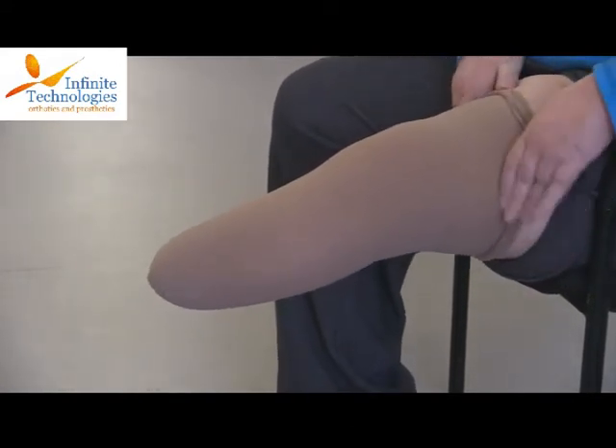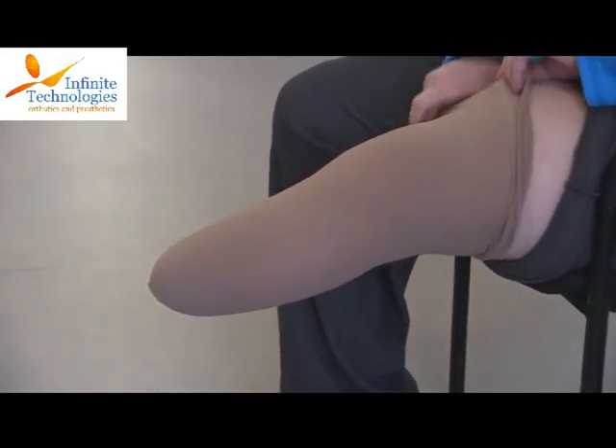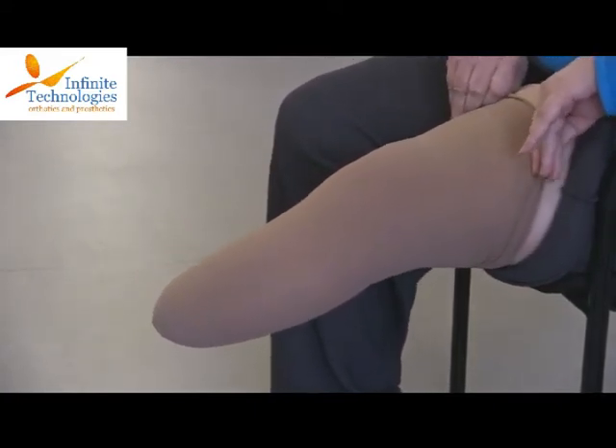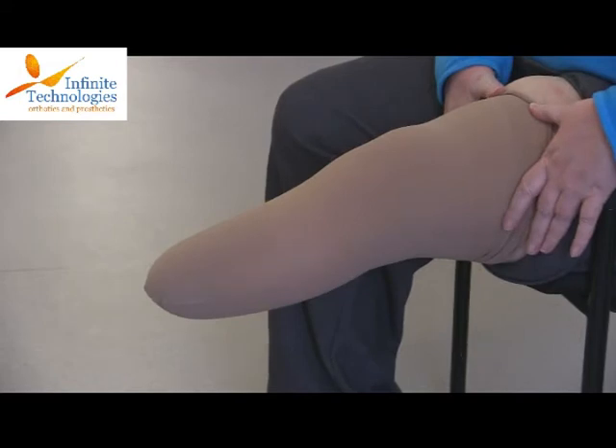It is important to pull the shrinker above the knee so that it does not bunch behind her knee, which can lead to pain and discomfort. Make sure there are no wrinkles in the shrinker.